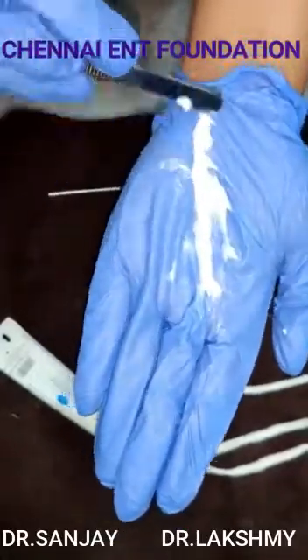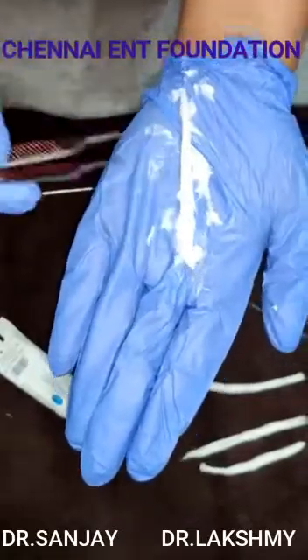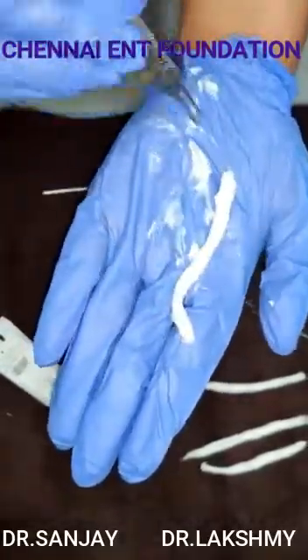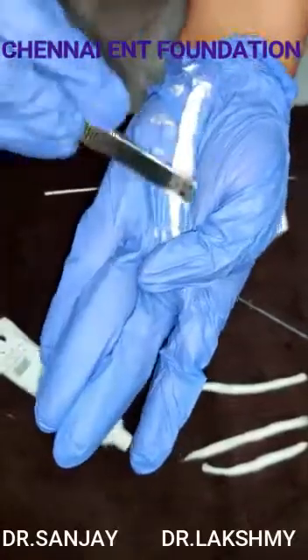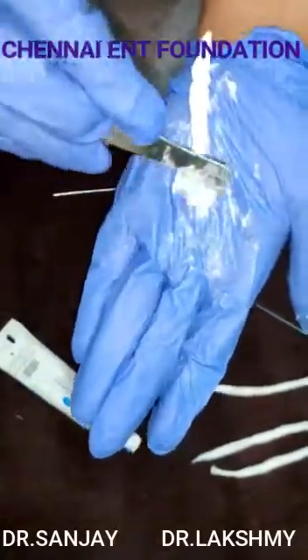You can use the back side of a spoon to spread the ointment evenly and liberally all over the cotton wick. You can see I'm flipping the cotton wick over and continuing to spread the ointment over the wick.